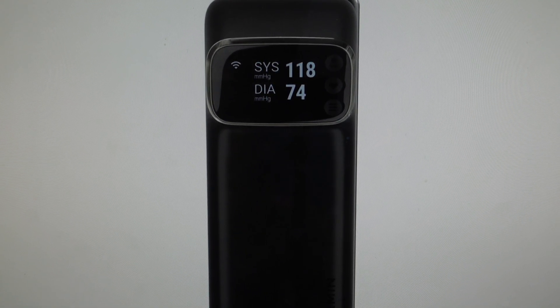Hey everybody, this is a quick video in case you have a Garmin Index BPM Smart Blood Pressure Monitor and you need to do a hard reset to the factory default settings on it.